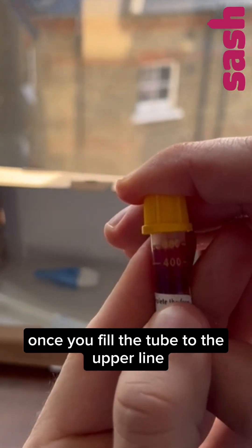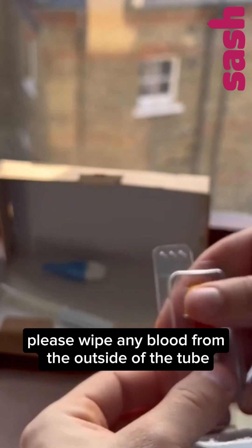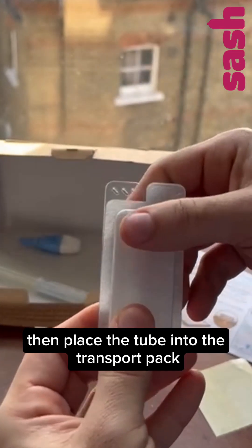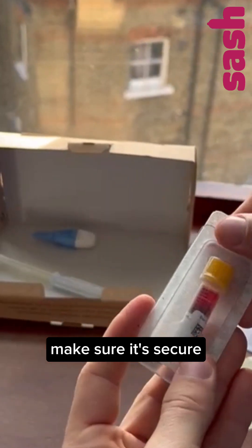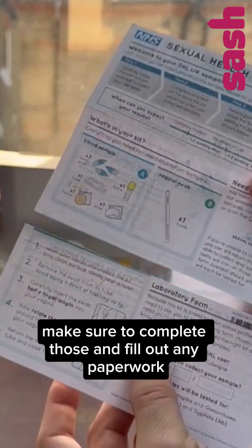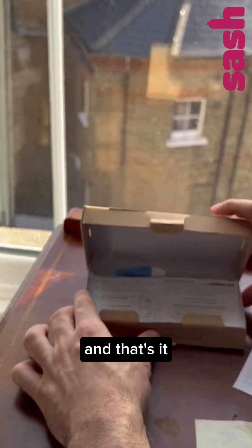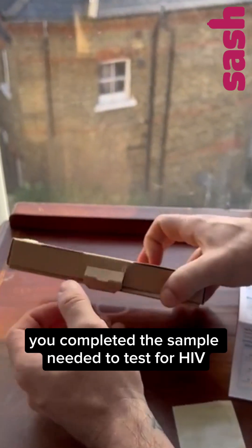Once you've filled the tube to the upper line, tightly press the cap onto the tube. Please wipe any blood from the outside of the tube. Then place the tube into the transport pack. Make sure it's secure. If your kit has other STI testing samples, make sure to complete those and fill out any paperwork such as the date that you collected your sample. And that's it! You've completed the sample needed to test for HIV.